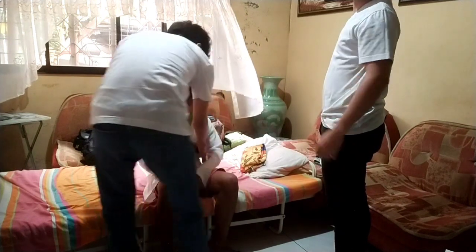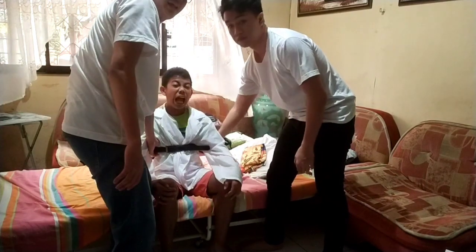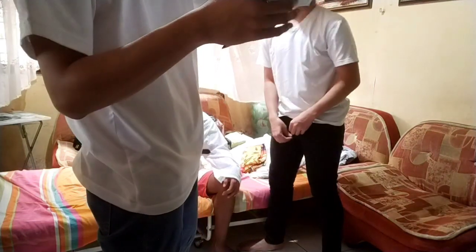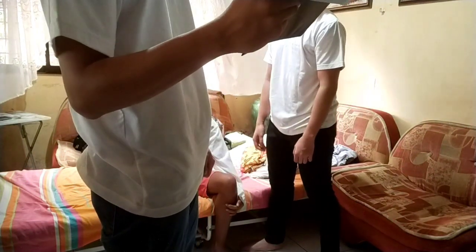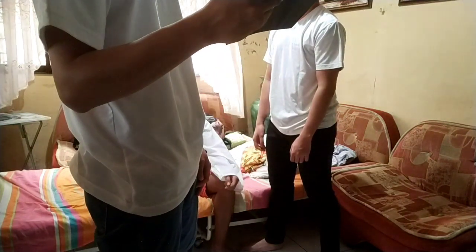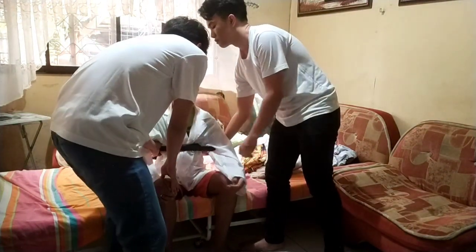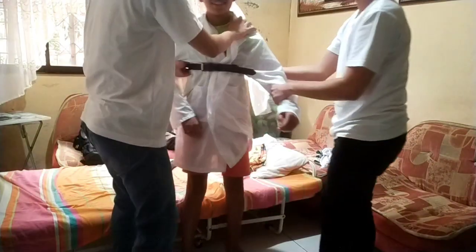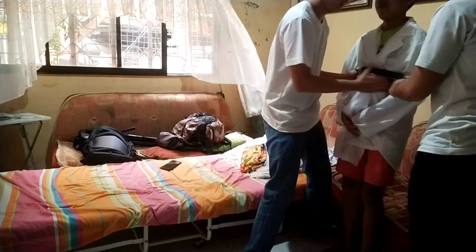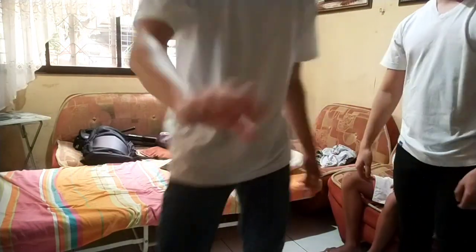Sir, you should move it. So the next procedure is coordinating efforts. All three of you stand simultaneously, pivot, and move to the wheelchair. Reverse the process to lower the client into the wheelchair seat. So now, sir, in a count of 3, 1, 2, 3, go. That's it, sir. And now, sir. 1, 2, 3, oh. And that's how you transfer a client with two nurses.